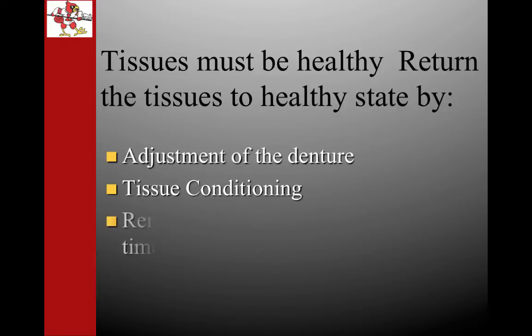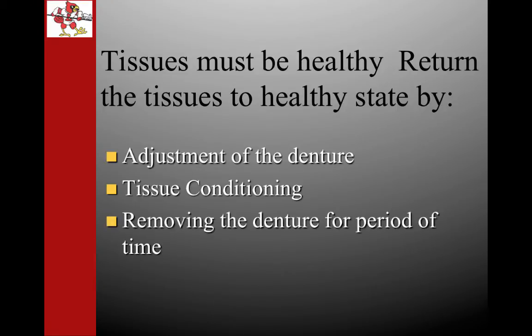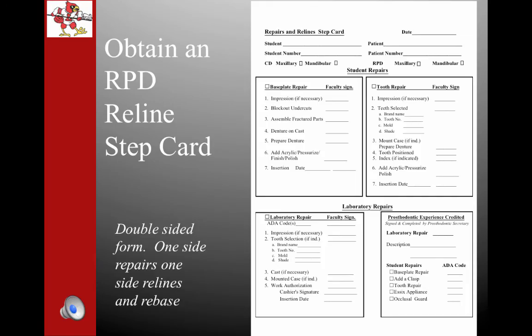The patient can also remove the denture for a period of time, but this is not always possible for the patient who works and does not want to be seen by their spouse with the denture out. Also, during that time, warm saltwater rinses are helpful during this healing phase. Before you begin, obtain an RPD step card for relines that is available in the clinics and get each step checked off as you proceed. It's a double-sided form with repairs on one side and relines on the other.